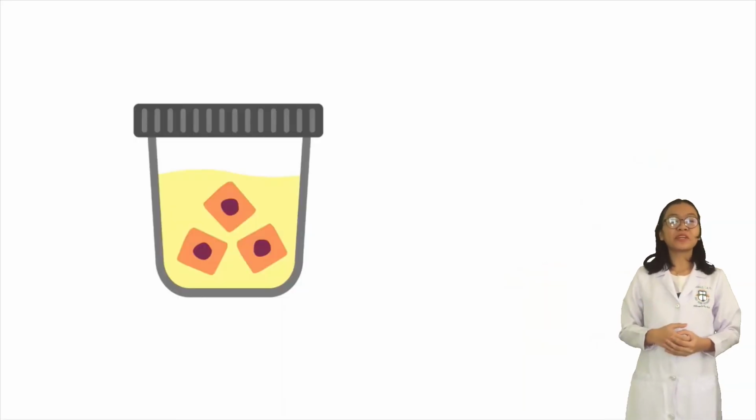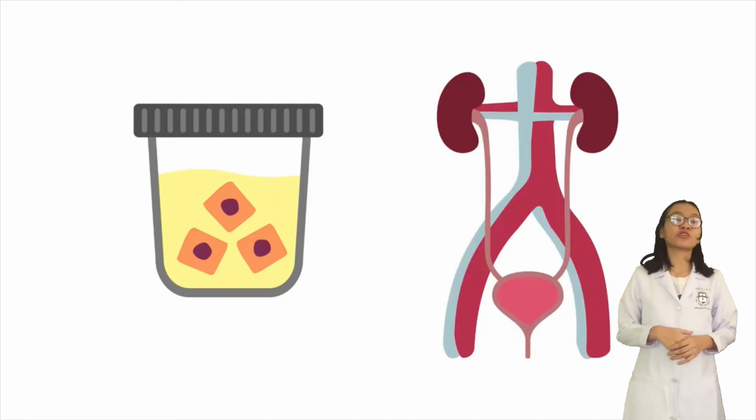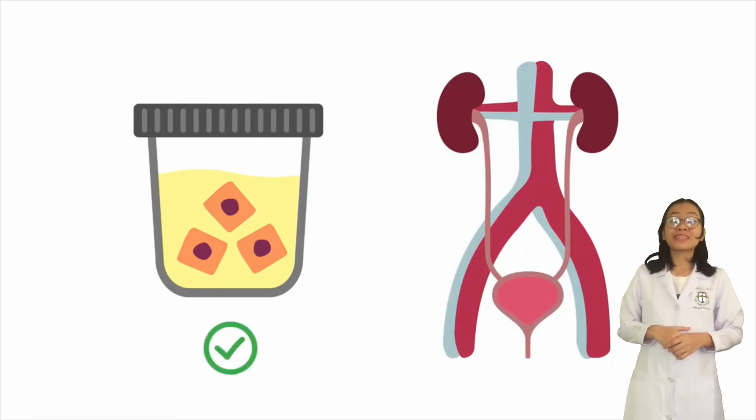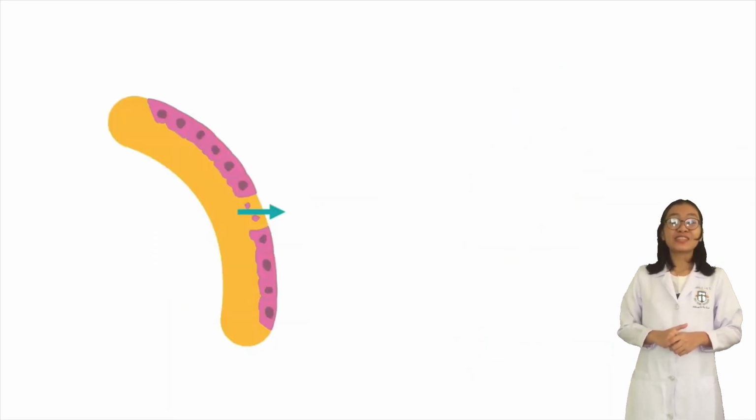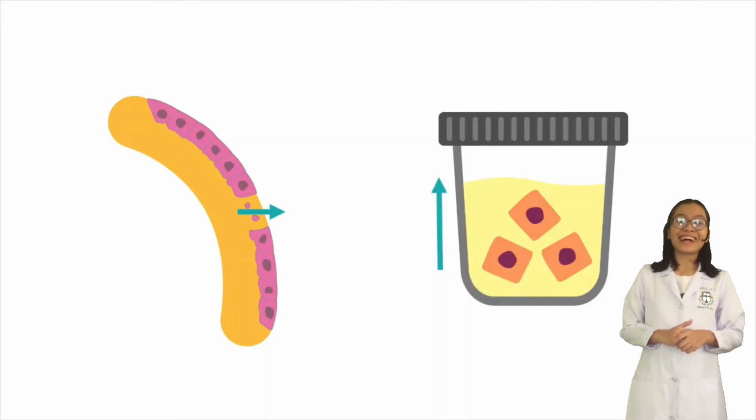Epithelial cells may appear in the urine after being shed from anywhere within the genitourinary tract. Thus, epithelial cells are often a normal finding in the urine. In some conditions, such as those associated with tubular damage, you may see an increased number of epithelial cells in the urine.